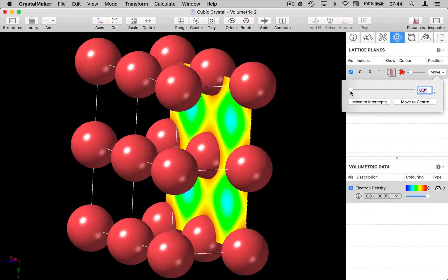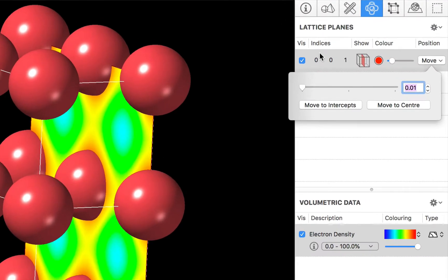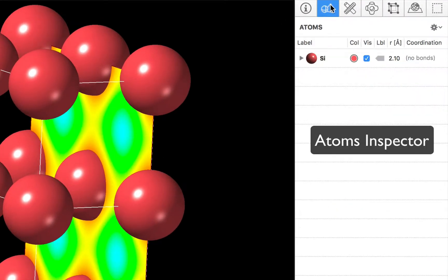Now the atoms are in the way so I'm going to hide my atoms and just focus on the volumetric data. To do that we'll go to the atoms inspector and we'll hide all of our atoms.